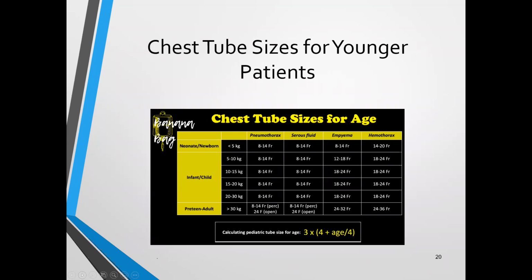And then a little bit of guidance on chest tube sizes for age, and really looking at not just age or category, but also the intersection of that with their specific abnormality: pneumothorax versus empyema versus a hemothorax. So they're going to vary a little bit. Air is better able to be evacuated than fluid. So in the main, particularly when you're talking about blood, you're looking at using a somewhat larger chest tube size for a hemothorax versus, let's say, a pneumothorax.